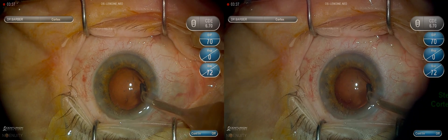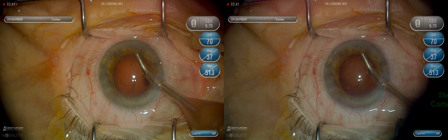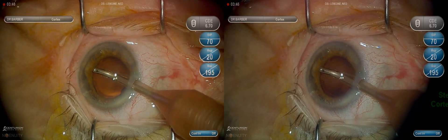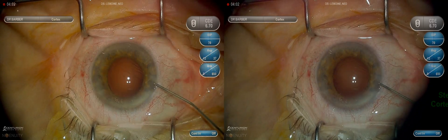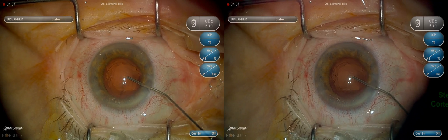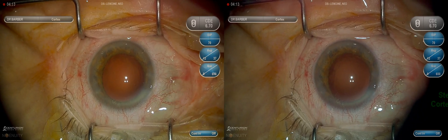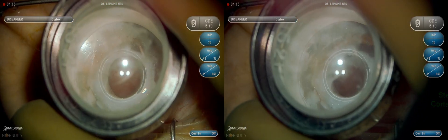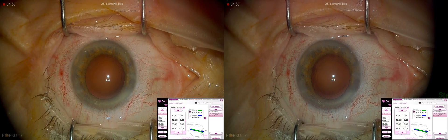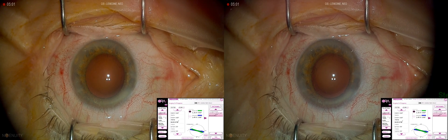We will now remove any remaining dispersive viscoelastic as we will perform Aura intraoperative aberrometry in this case. We will perform a full and complete fill of a visco-cohesive viscoelastic and check the pressure with applanation, which is important when doing Aura intraoperative aberrometry. You can see the Aura measurements here that have verified the axis and magnitude of astigmatism.